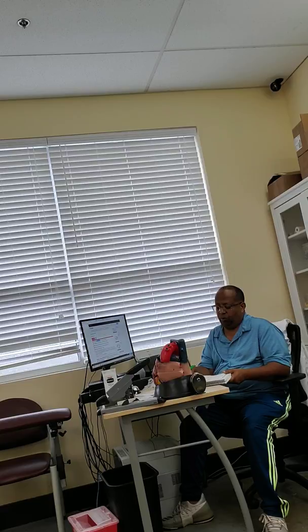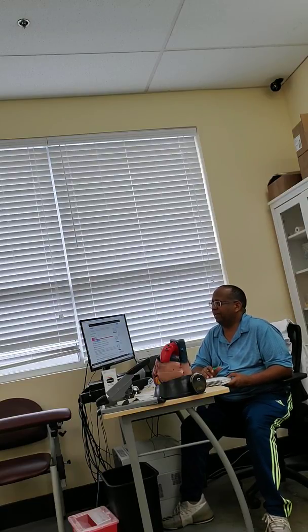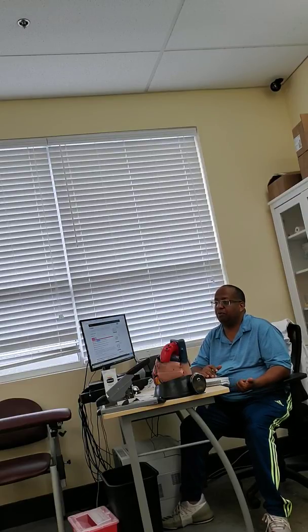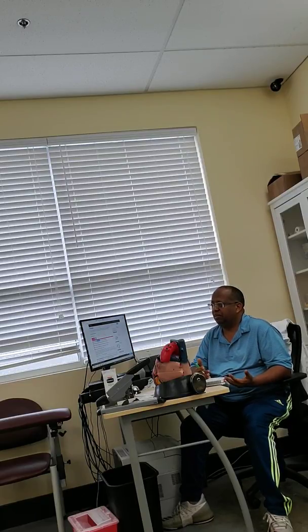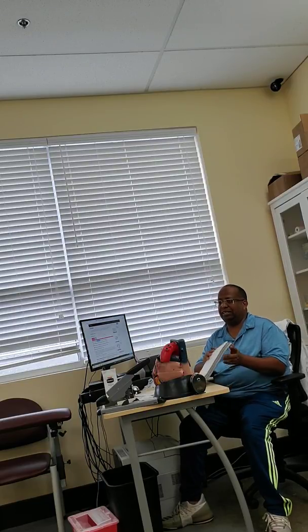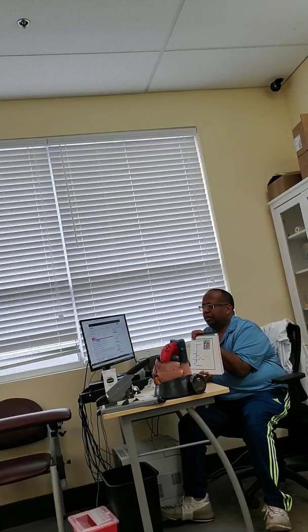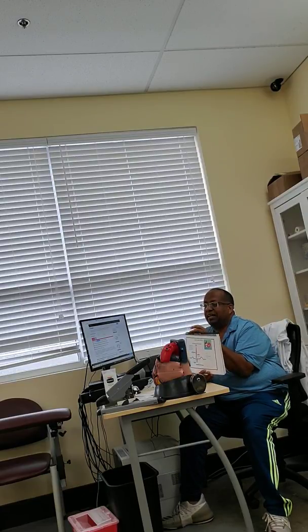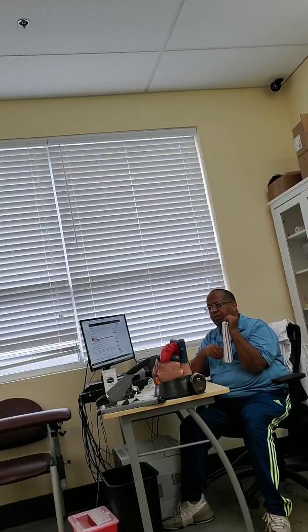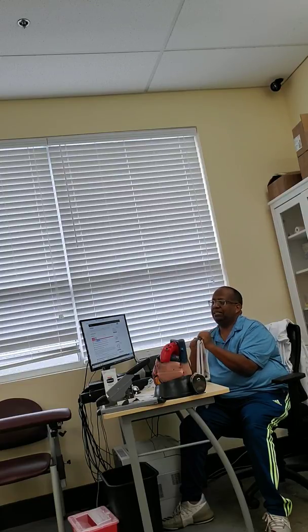So when we say waves, they go what? Either up or down. When the waves go up, it's called an upward deflection, or also called positive. When it's going down, it's negative or downward deflection. In this case, which ones go upward? R is going up. P is going up, R is up, T is up. What about Q? Down. S, down. So Q and S are down.